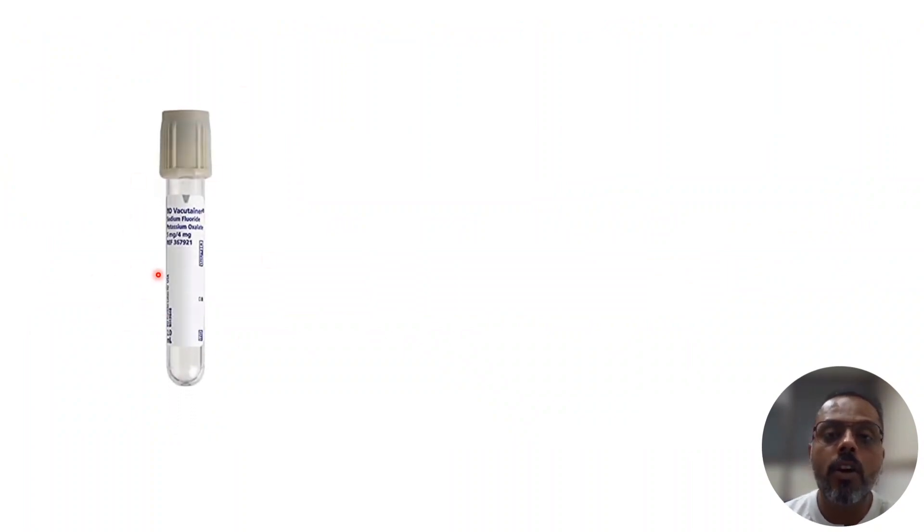This is the picture of fluoride vacutainer. It is a gray color tube. You have to collect the blood for glucose estimation in this fluoride vacutainer. If you don't collect the blood in fluoride vacutainer for glucose estimation, it can result in a lower blood glucose value. In the case description, the person is completely normal but the blood glucose level was 42 milligram per deciliter, so that is towards hypoglycemia. It can result in a misdiagnosis.